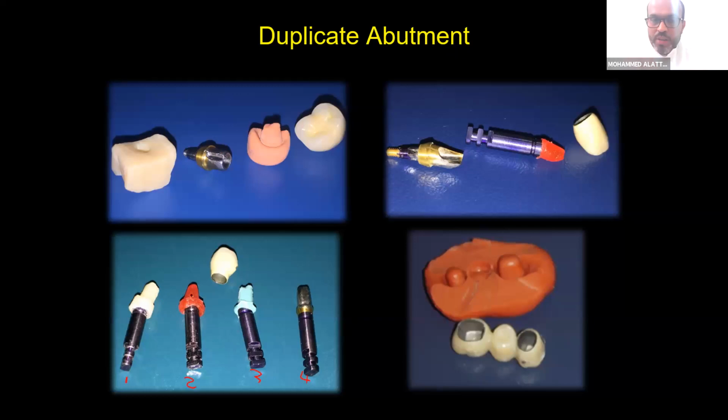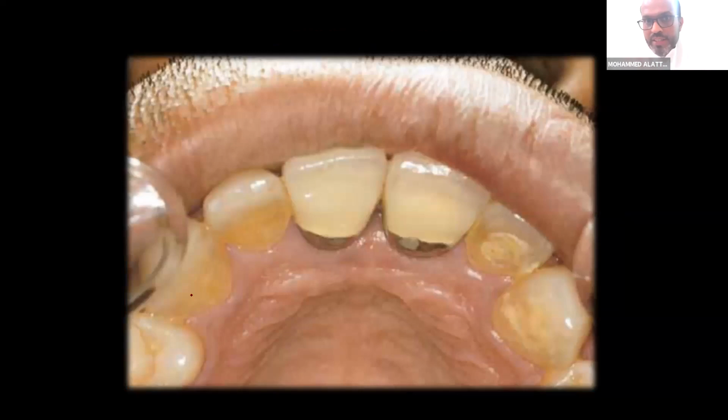And what I found in the literature is that in one case, they did a venting to control the excess cement. But this point in this area will end up with a crack of the porcelain.